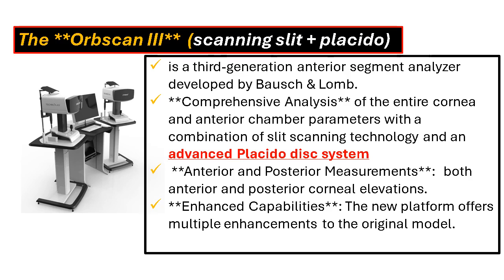However, it is not that famous and popular among doctors, who believe that the scanning slit technology is not as accurate as the Scheimpflug technology present in the Pentacams and all the tomography systems that are based on Scheimpflug. And there are even some studies showing that the scanning slit technology is not as accurate as Scheimpflug.